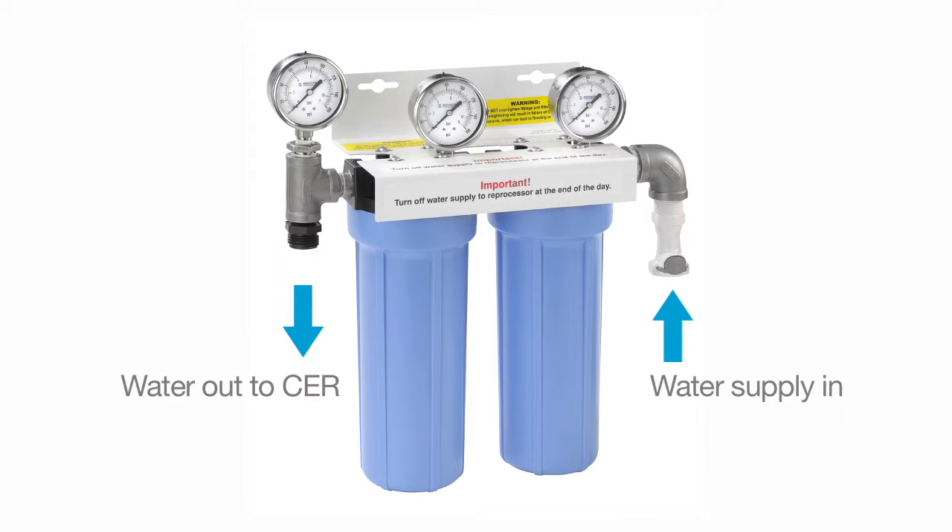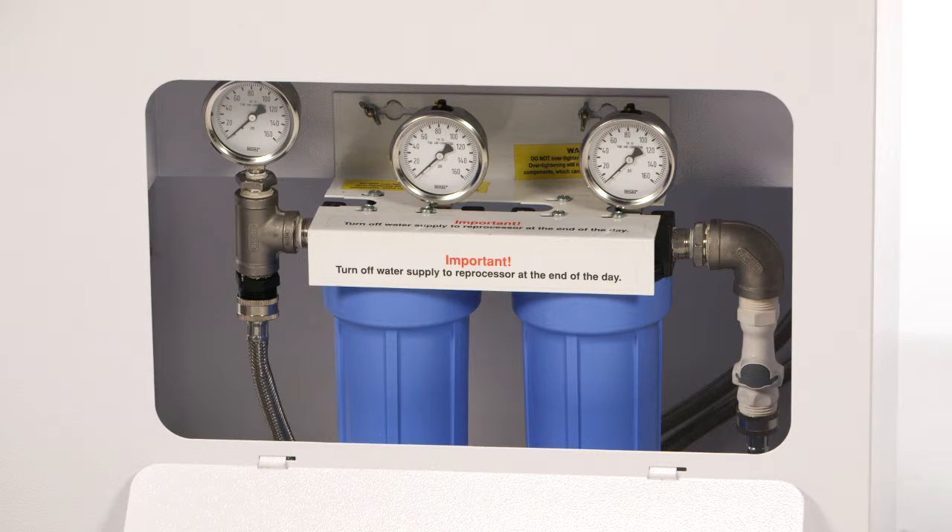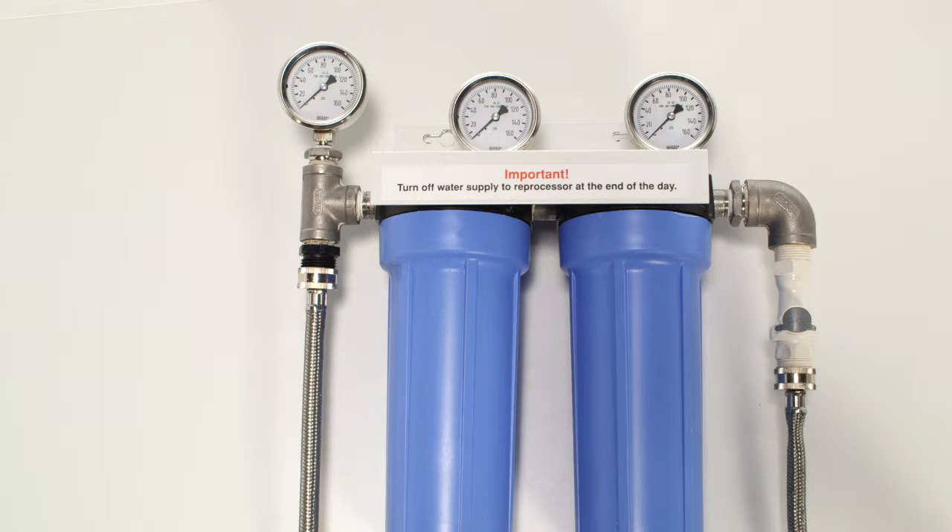The CER Optima requires an incoming cold water supply connection, which must include a water shutoff valve. The incoming water pressure must be between 40–60 psi and provide a flow rate of 2–3 gallons per minute. The water filtration system is installed in-line at a convenient location within 3 feet of the CER unit. The water filtration system can be mounted inside the cart or to the reprocessing room wall. Make sure to allow enough room under the water filtration system for removal of the water filter housings when filter replacement is required.